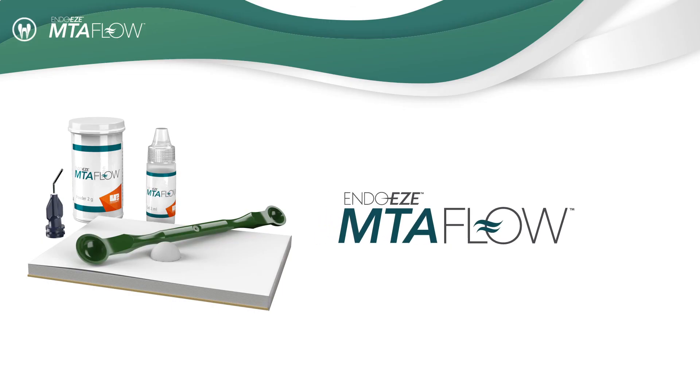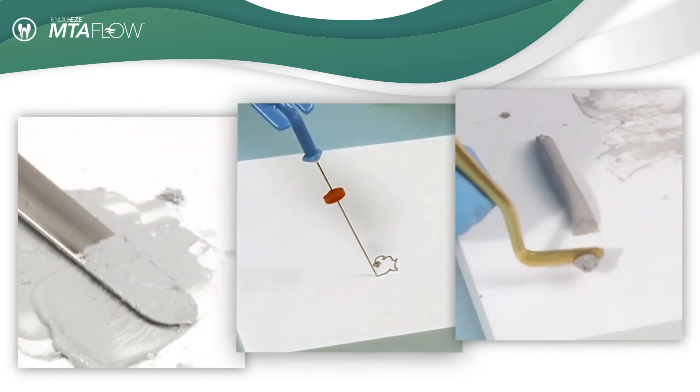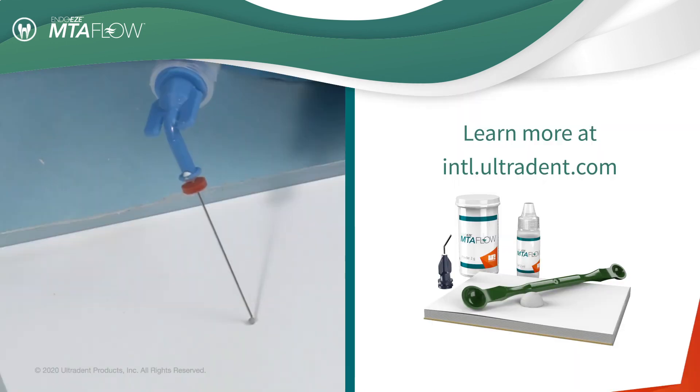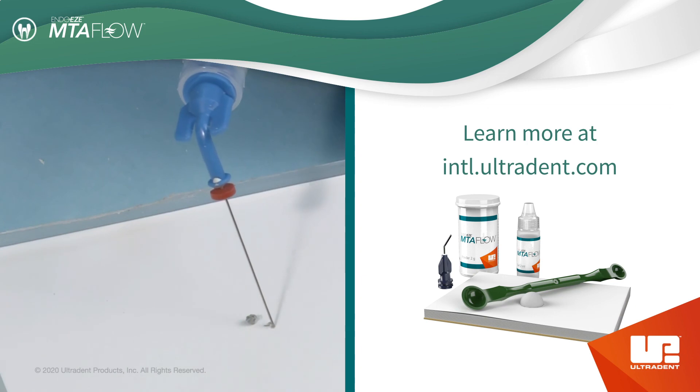Ultradent MTA Flow: easy to mix, easy to deliver, and the right consistency for the right procedure. For more information or for a product demonstration, contact your local representative.